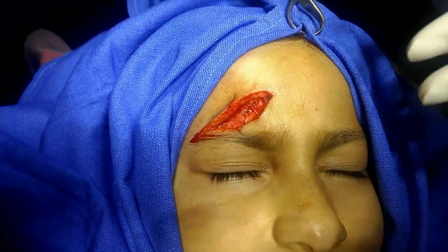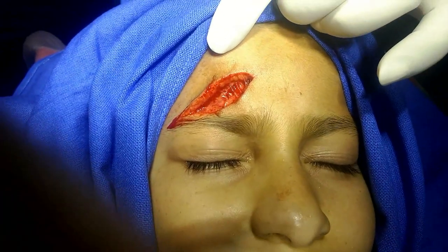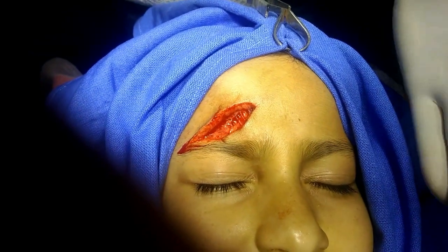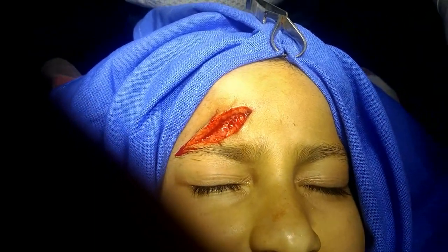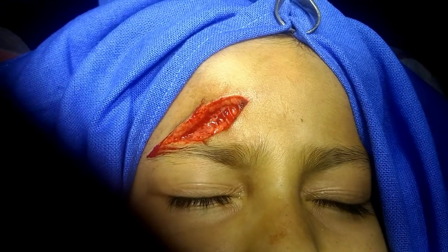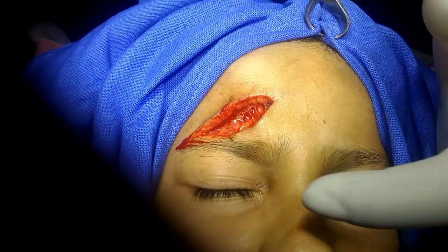This patient has an accidental lacerated wound on the right side of the forehead, so I am planning to repair it meticulously under regional anesthesia — that is, a supraorbital nerve block.